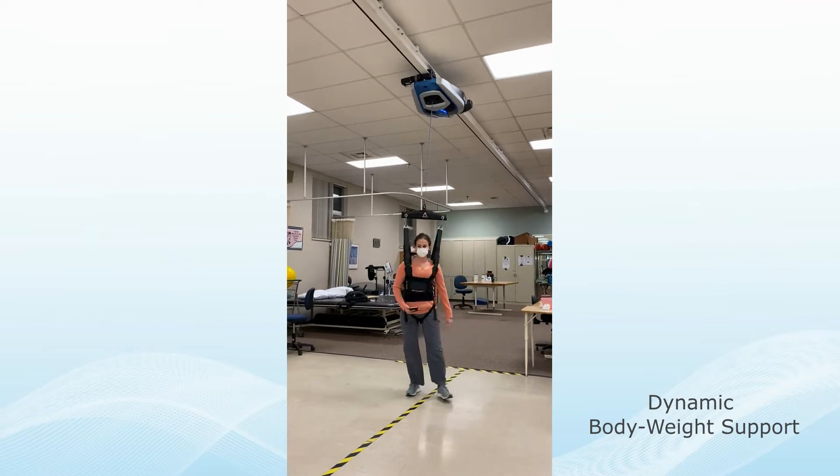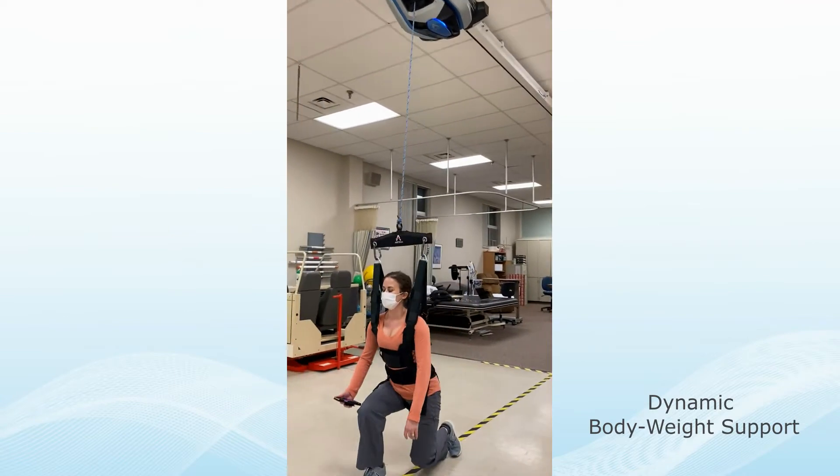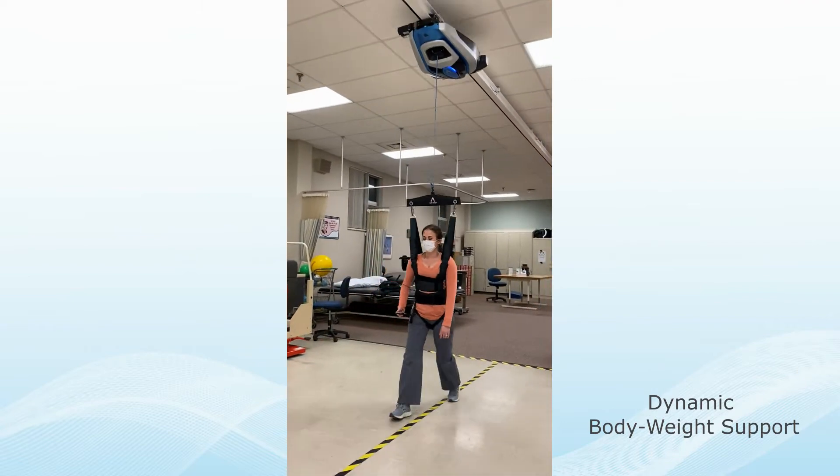Dynamic Bodyweight Support allows natural movements to be performed on stairs, walking over ground, and getting off the floor without restrictions.